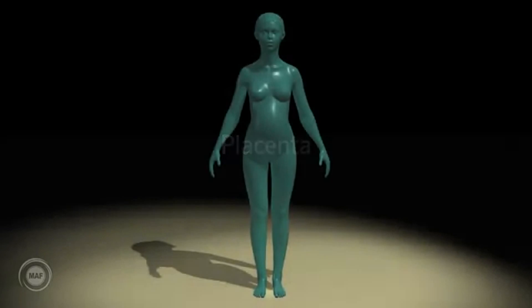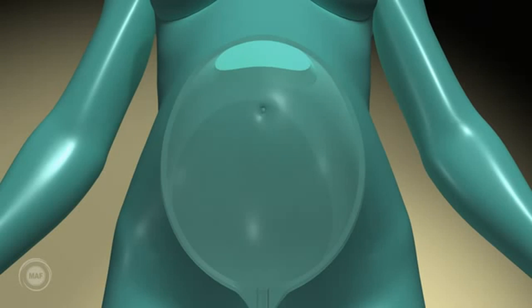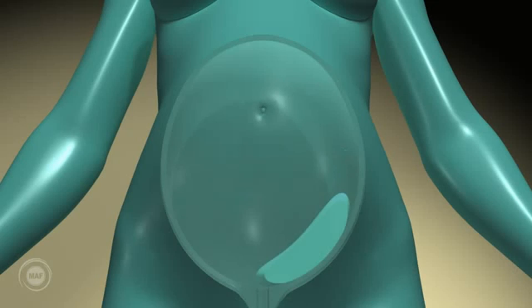Placenta. The placenta can be located in the upper part or the lower part of the uterus in an anterior or posterior position. A placenta inserted in the lower segment of the uterus is regarded as low, or as a placenta previa if close to, reaching or covering the cervix.